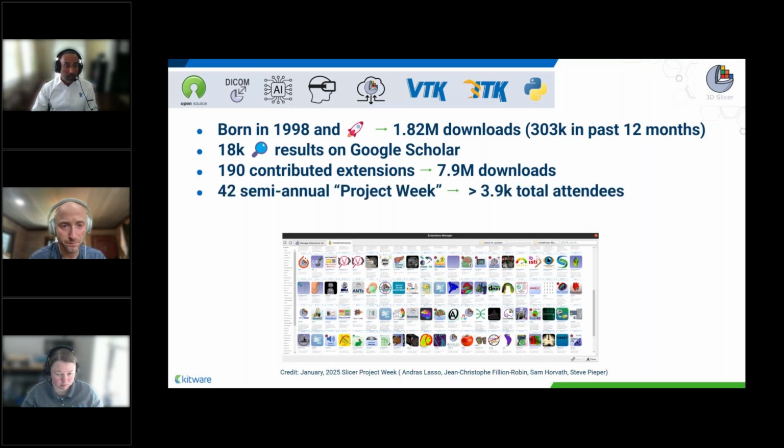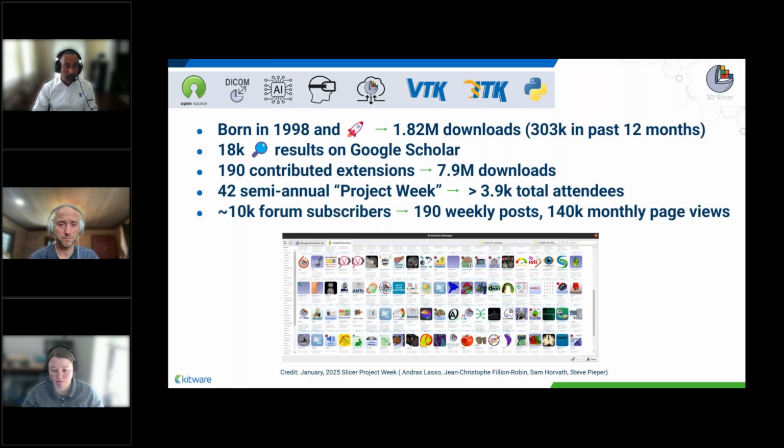And also, one of the main continued growing uses of 3D Slicer is its extensions. There are close to 190 extensions which have been downloaded nearly 8 million times. So there's more and more development of extensions and a huge use of extensions. We continue to host or participate in the Slicer community in what we call a project week, where computer scientists, clinicians, and algorithm developers get together, and we've had more than 42 different events.